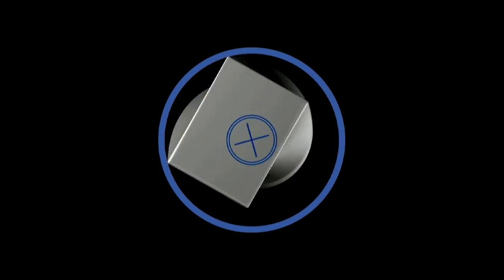Once there's a revolution with one of these instruments, that shape exists. As opposed to ProTaper Next, where the center of the file, as you can see with the X, stays there, and yet there are only 2 points of contact. And if you imagine looking up the shaft of the ProTaper Next, it does appear to be a serpentine coming at us. It's taking that horizontal cross-section and cutting in 2 points.